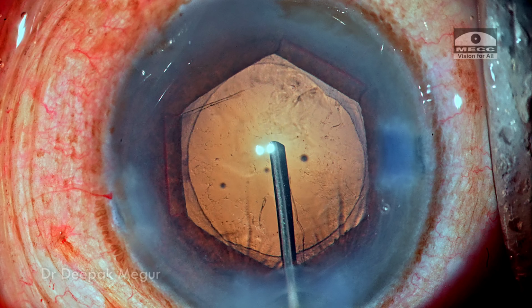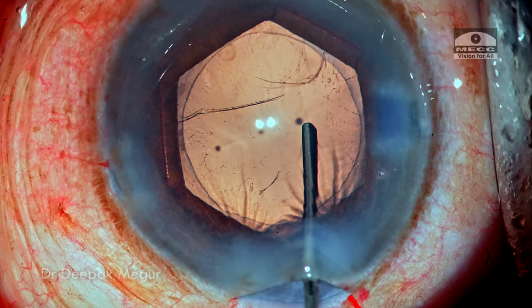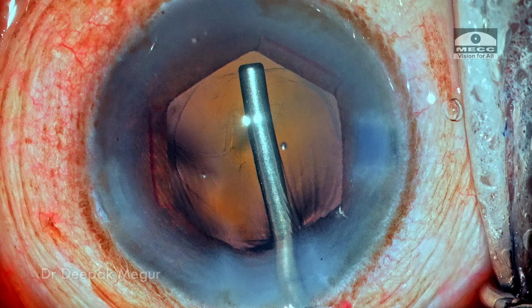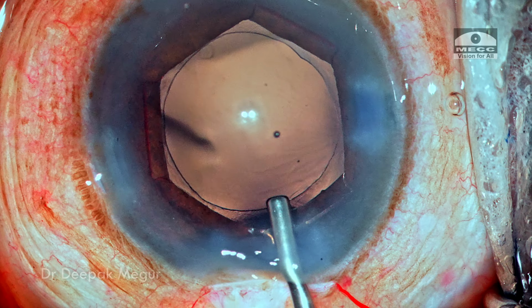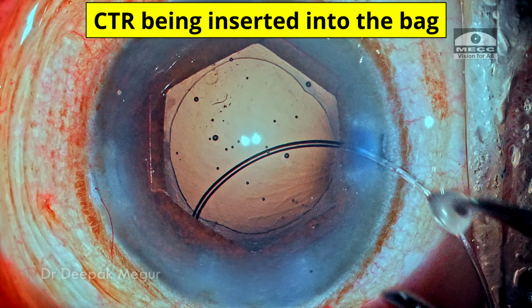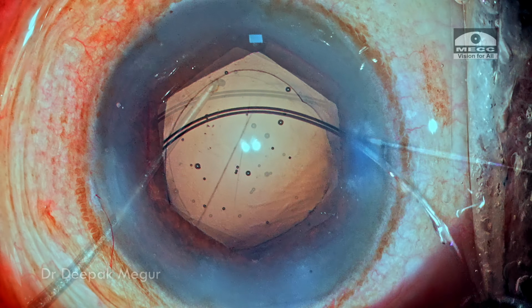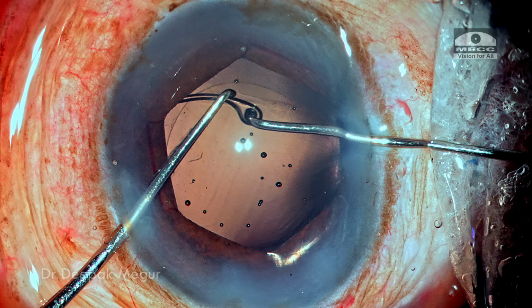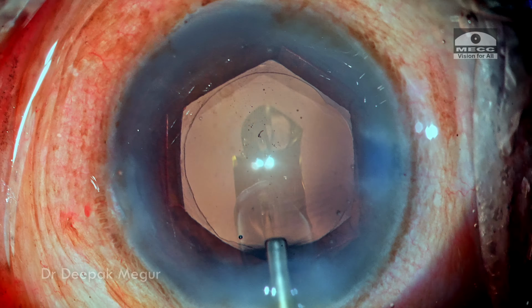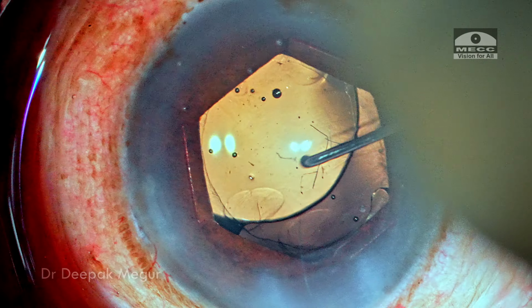So I'm going to push BSS across the posterior capsule. This ensures that the posterior capsule is cleaned off, and this is one of the easiest ways to clean the posterior capsule. Only care to be taken is that the cannula need not be very close to the posterior capsule. Gentle irrigation of BSS across the posterior capsule usually clears off all the small fibrils which are sticking onto the posterior capsule. The OVD is injected into the bag and the originally planned lens is dialed into the bag.